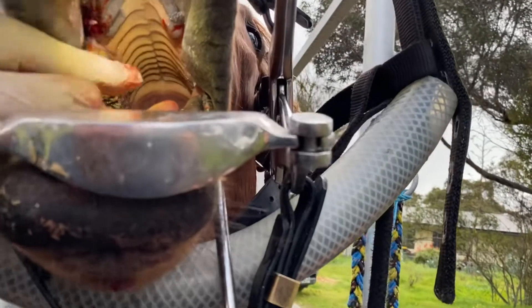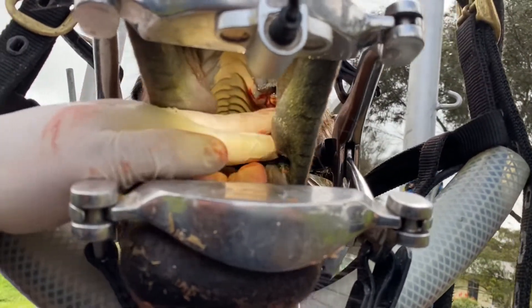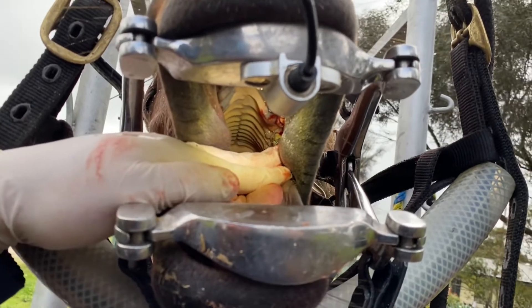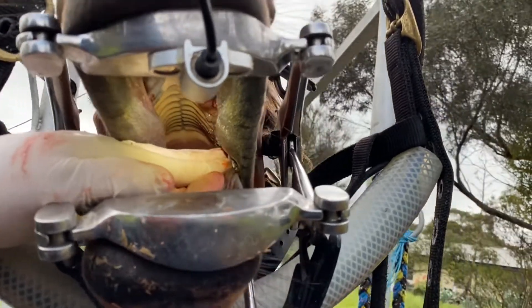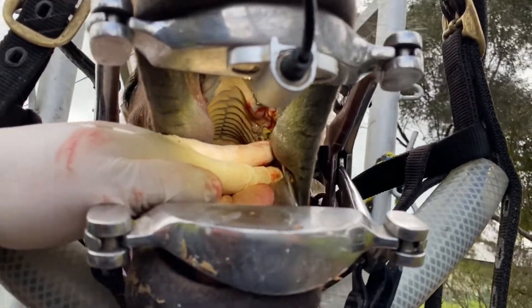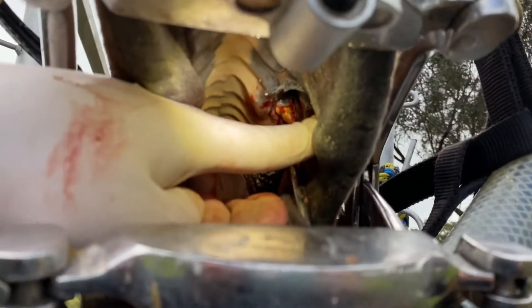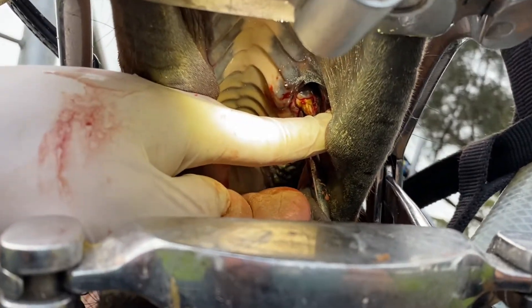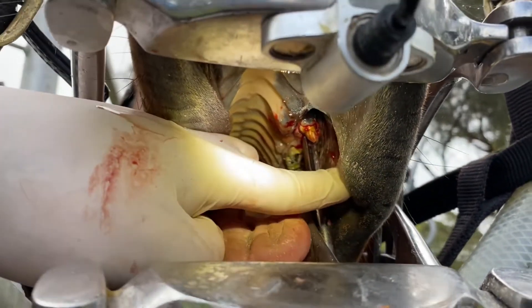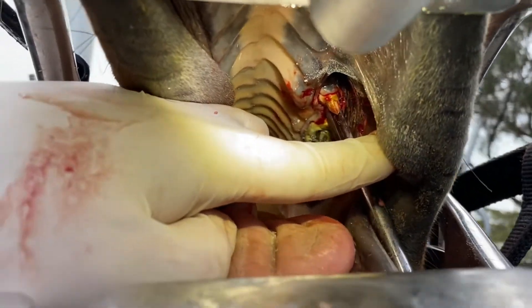This horse is doing really well because we've done a really nice nerve block on him — he can't feel what we're doing. We're just trying to get this out gently so he can go on and run really fast. We take our time, put a bit of pressure on that tooth, hold it for 20 seconds, twist and hold all the way around the tooth, weakening the periodontal ligament.